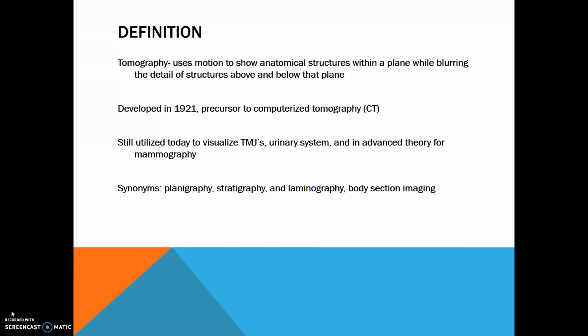It is still used today to visualize the TMJ joints, urinary system, and an advanced theory for mammography. Some synonyms of tomography include planigraphy, stratigraphy, laminography, and body section imaging.